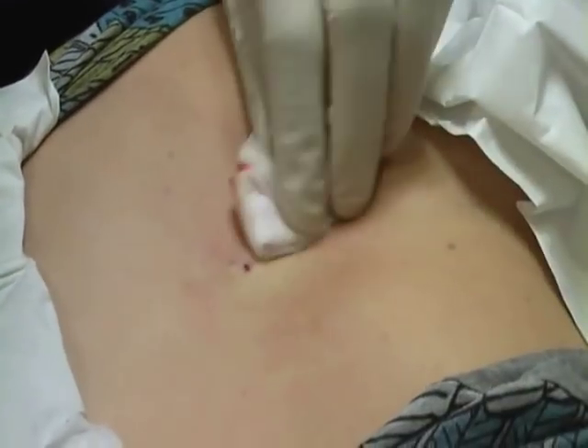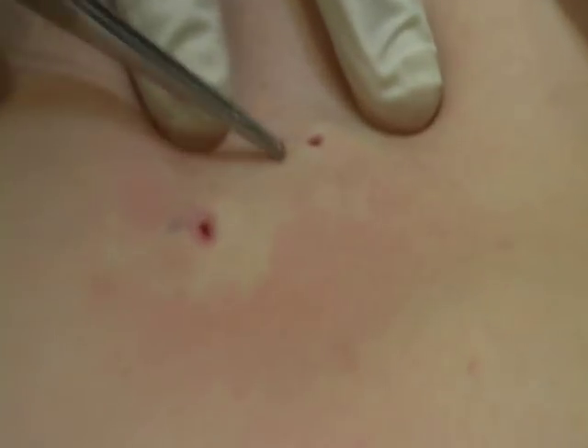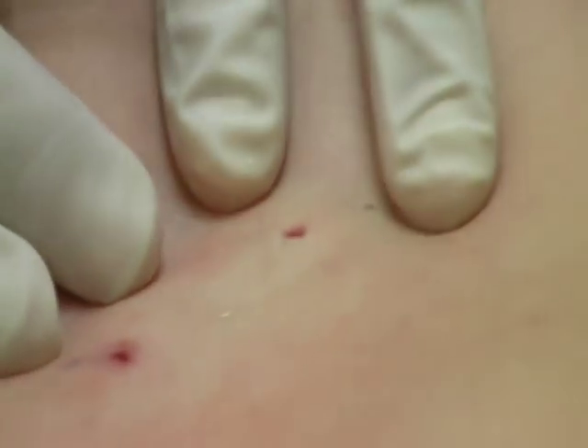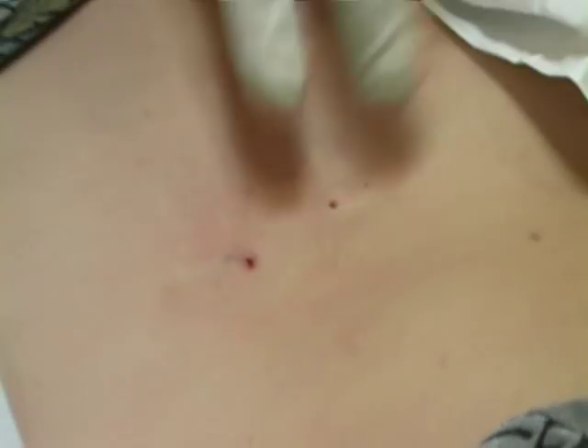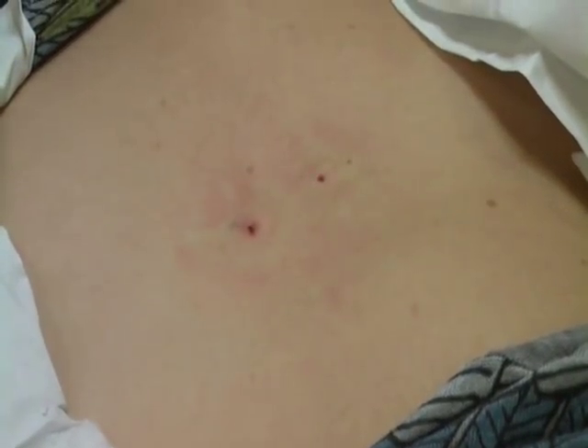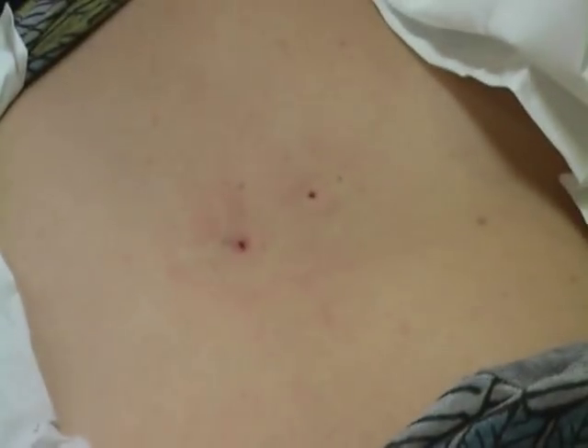If we just return to the scene of the crime — you can see there's a hole in the skin. I've just made a little bit of a nick just allowing me to flick out the tail of the piercing. We'll put some Steri-Strips on just to hold them gently closed but allow them to drain, and we'll put some Opsite on the top just to keep it nice and clean and dry. Both piercings out.